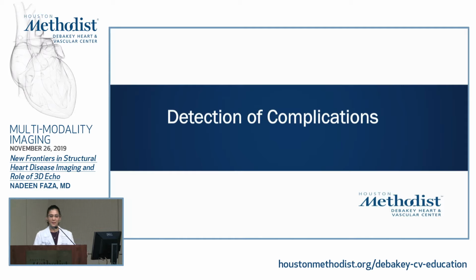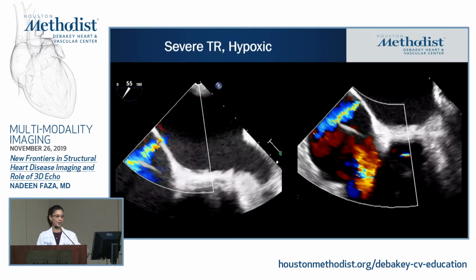Lastly, 3D and echocardiography in general is very important in detecting immediate post-procedural complications. It's important to monitor the patients continuously during these long procedures. Sometimes they develop effusions, sometimes they develop device embolizations, shunts. So with any hemodynamic change, you have to re-image and make sure you're not missing a life-threatening complication.